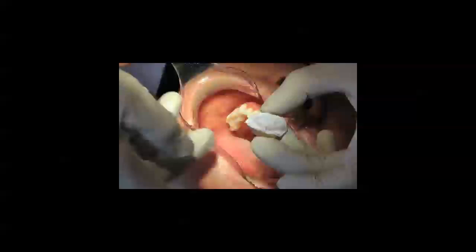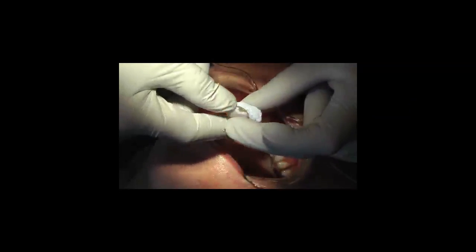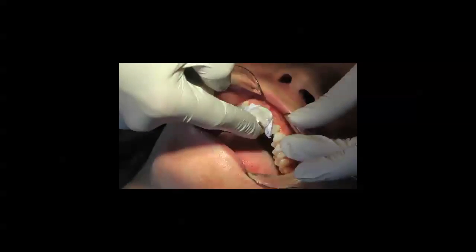What we'd like is for it to be full, have an accurate impression, and we'd like to make sure that it's rigidly attached to the teeth — that it doesn't just drop loose — so we can just confirm the fit.